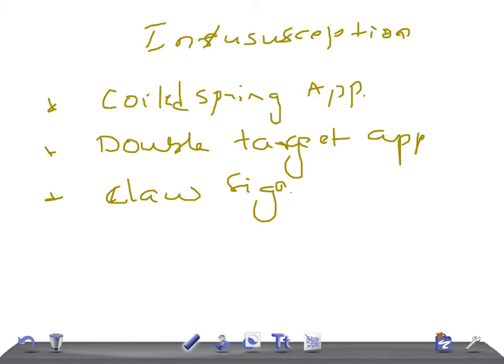And even you can do pneumatic reduction through the air. So these are the important radiological signs of intussusception. Thank you so much for watching this video. Take care.